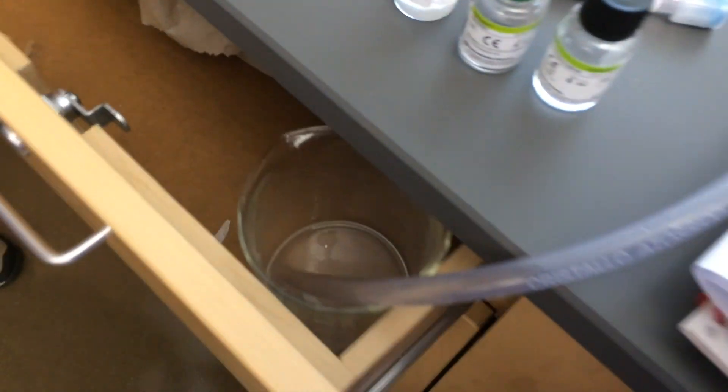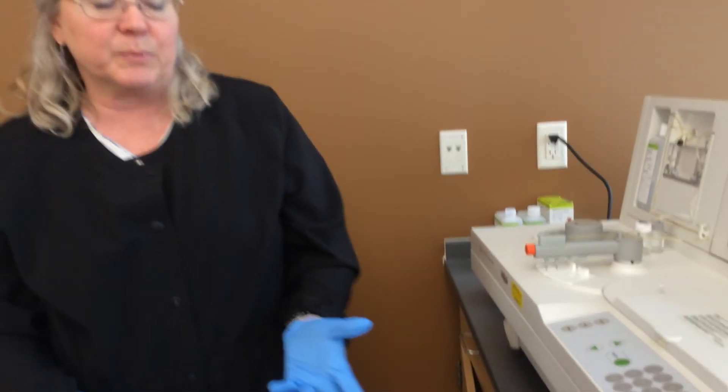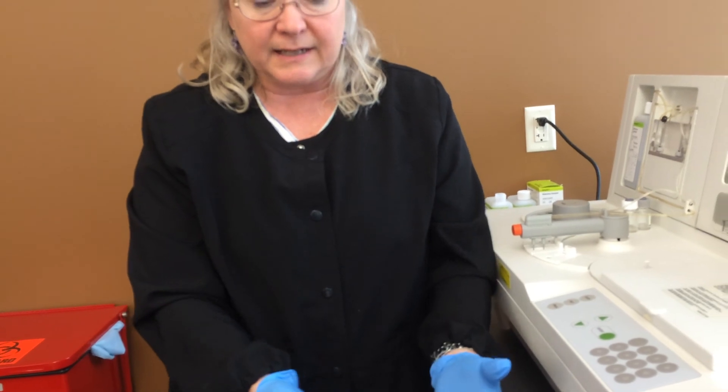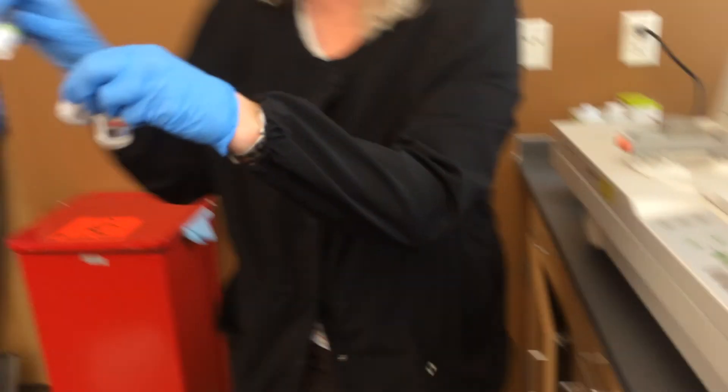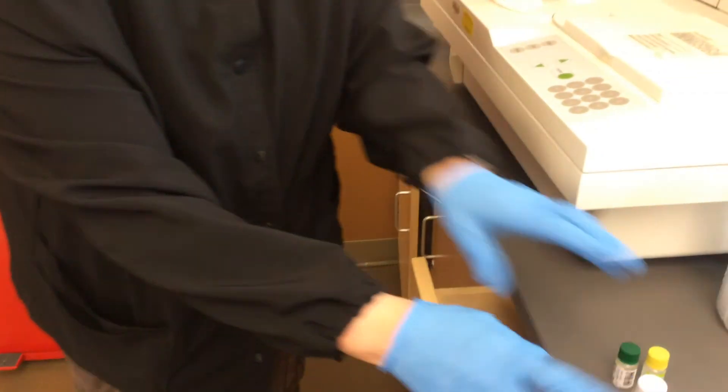This is the waste tube right here. Some labs might have it going down into a drain, but if it is in a container, you just have to wash it out every day. These are the reagents we're using today if any of you want to record the lot numbers. Those are the reagents I put on the analyzer.